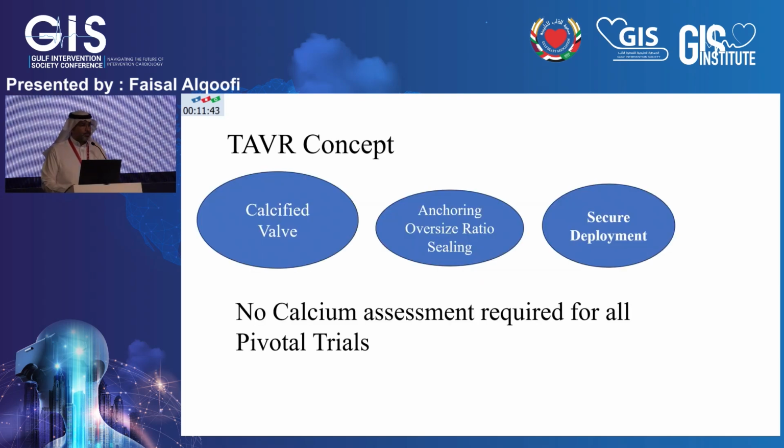The whole concept of TAVR when it started was around having a calcified valve. We learned over time about the anchoring, oversizing ratio, sealing, all those terms we learned over the last 15 years, and then subsequently secure deployment. But of note, there is no specific calcium requirement for any of the pivotal trials.